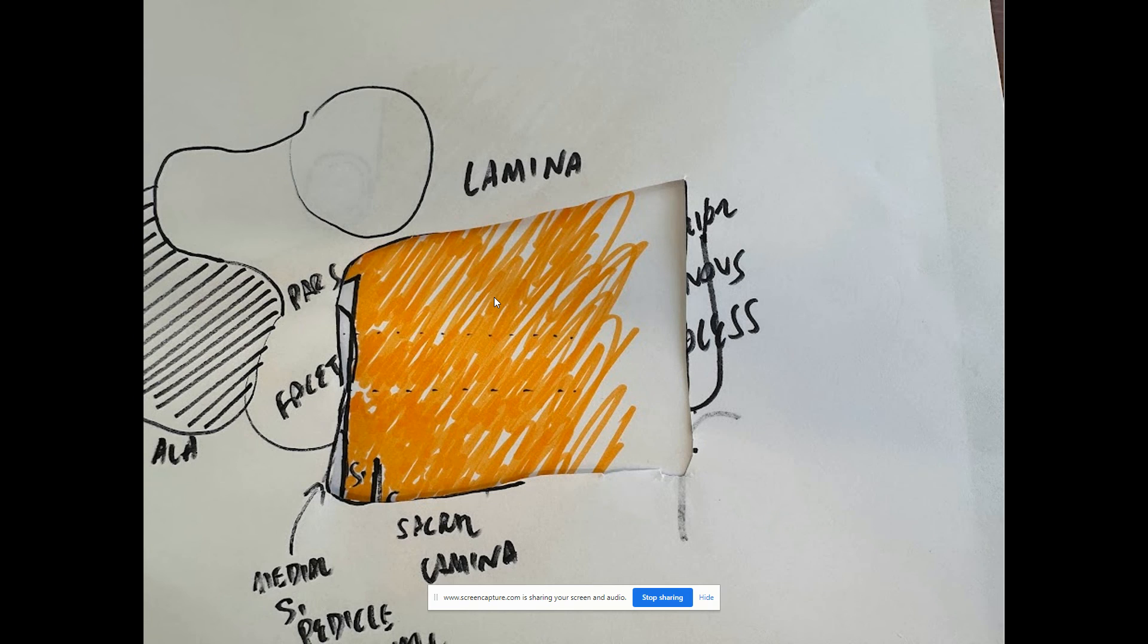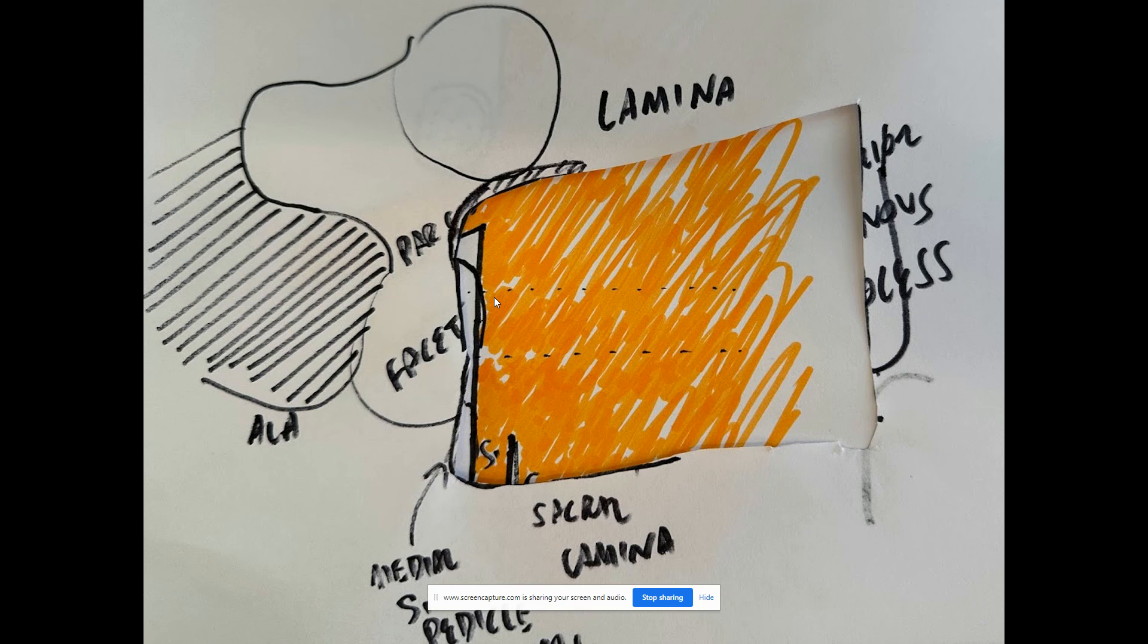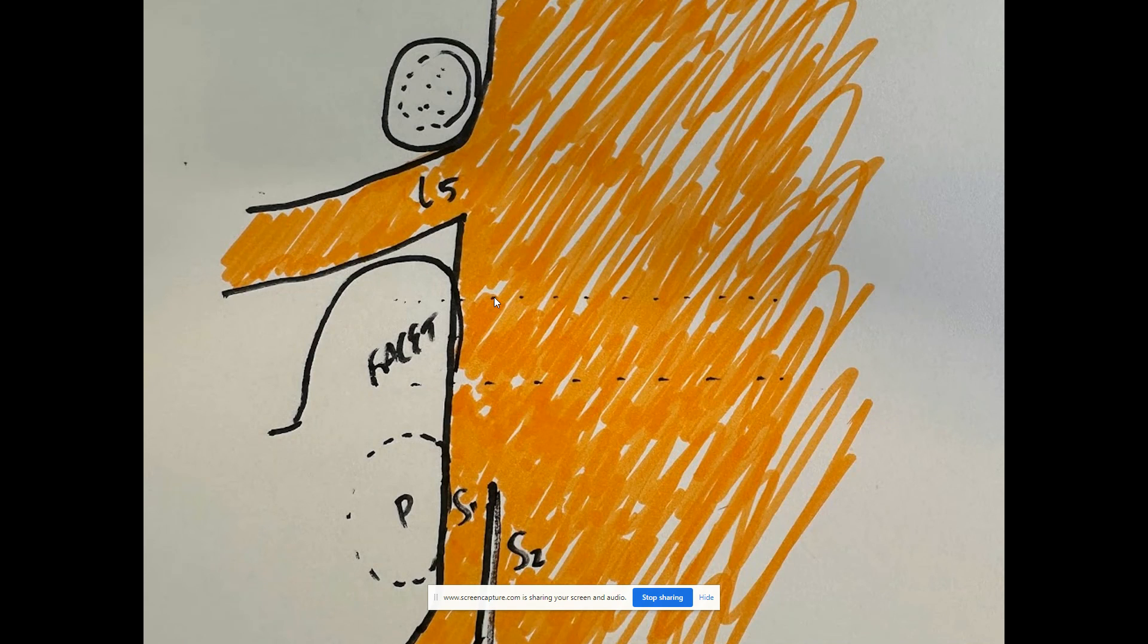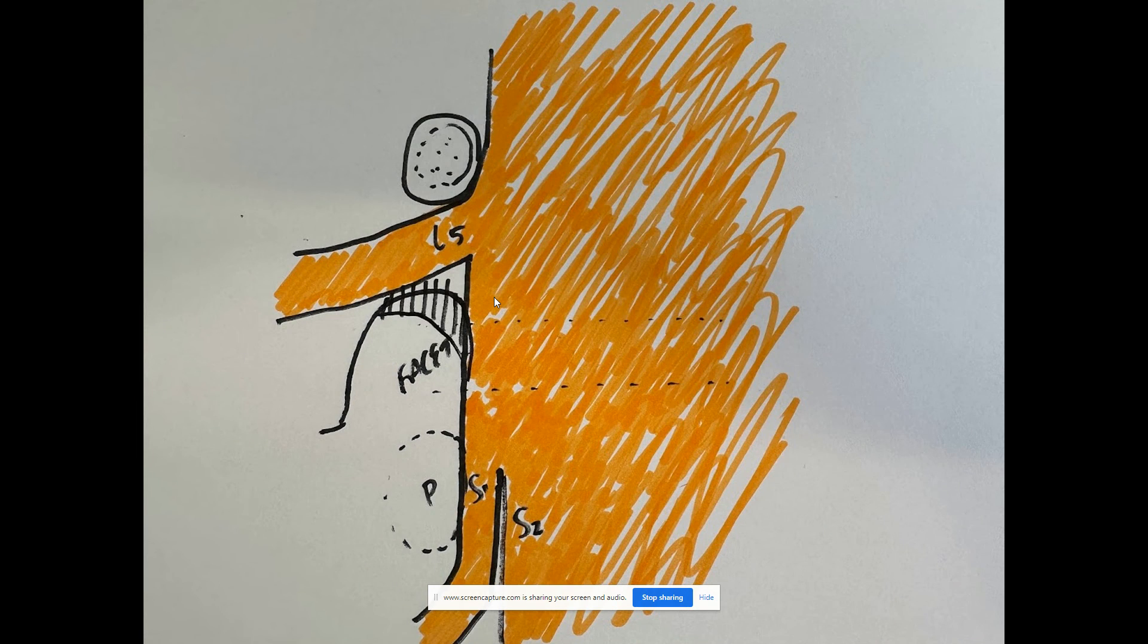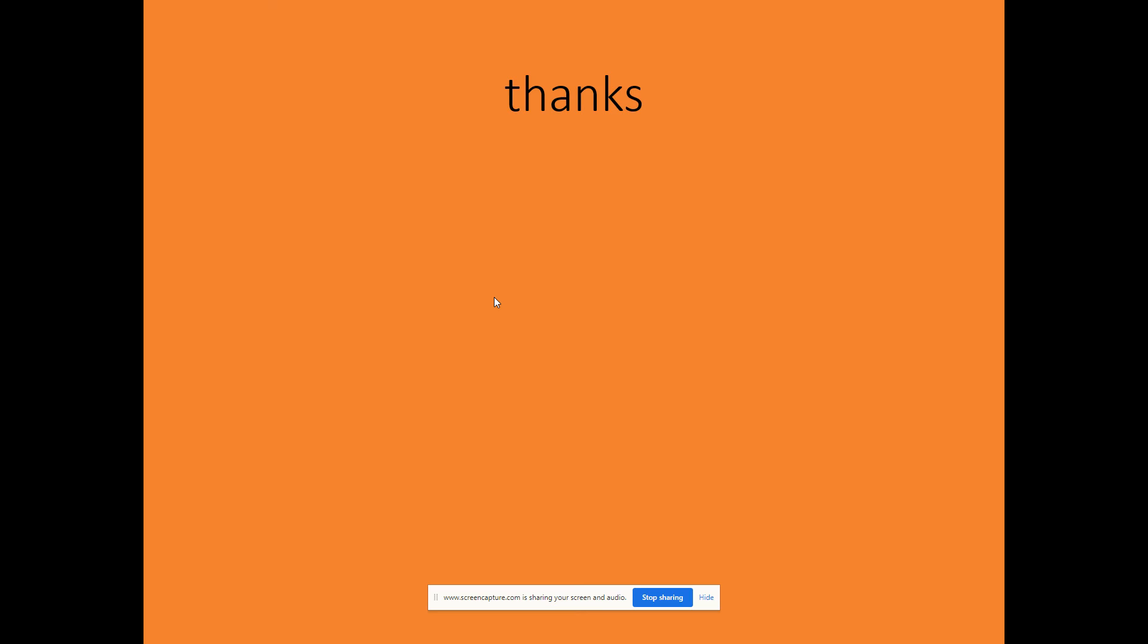You should be able to see the L5 nerve root has the same consistency as the dura. At some point you have to go to the opposite side of the table to remove the superior portion of the sacral facet. You don't want to remove all of it, but enough so that the nerve root has plenty of room.